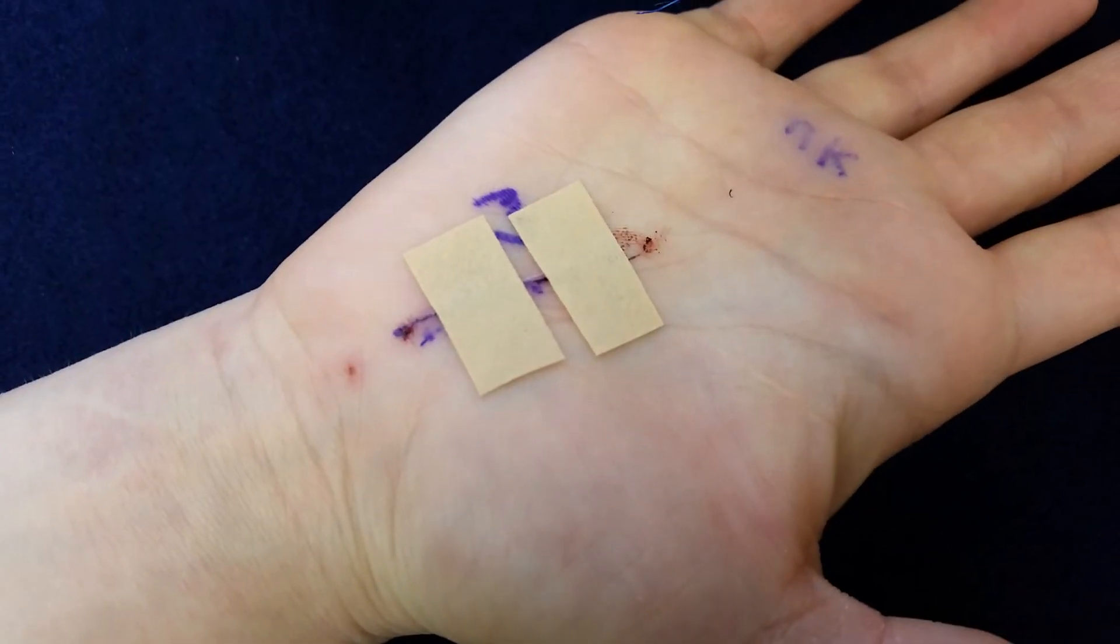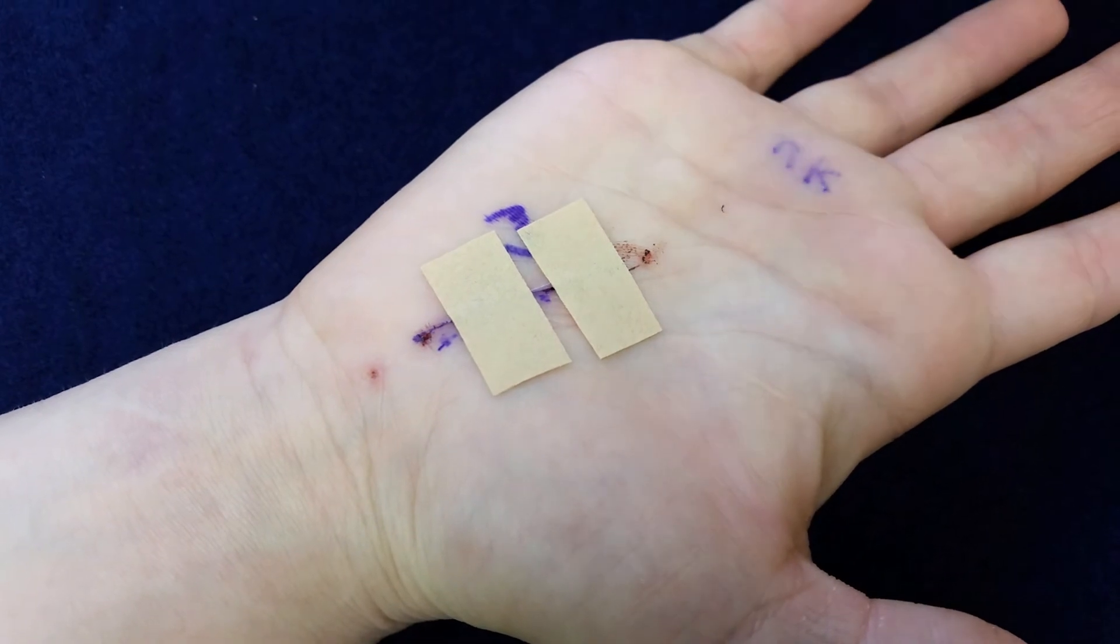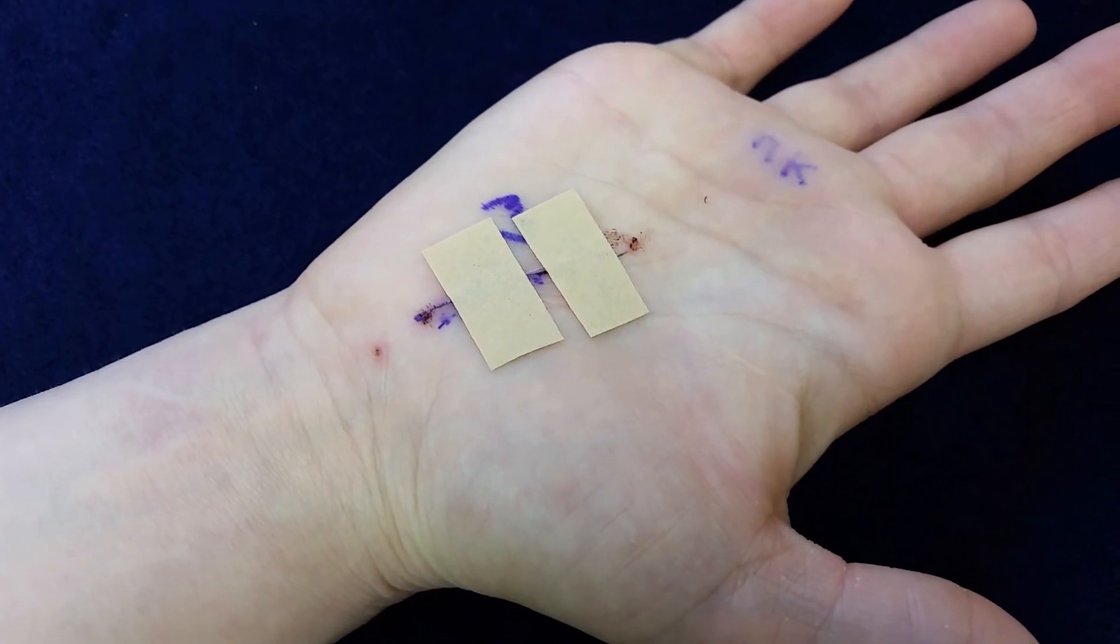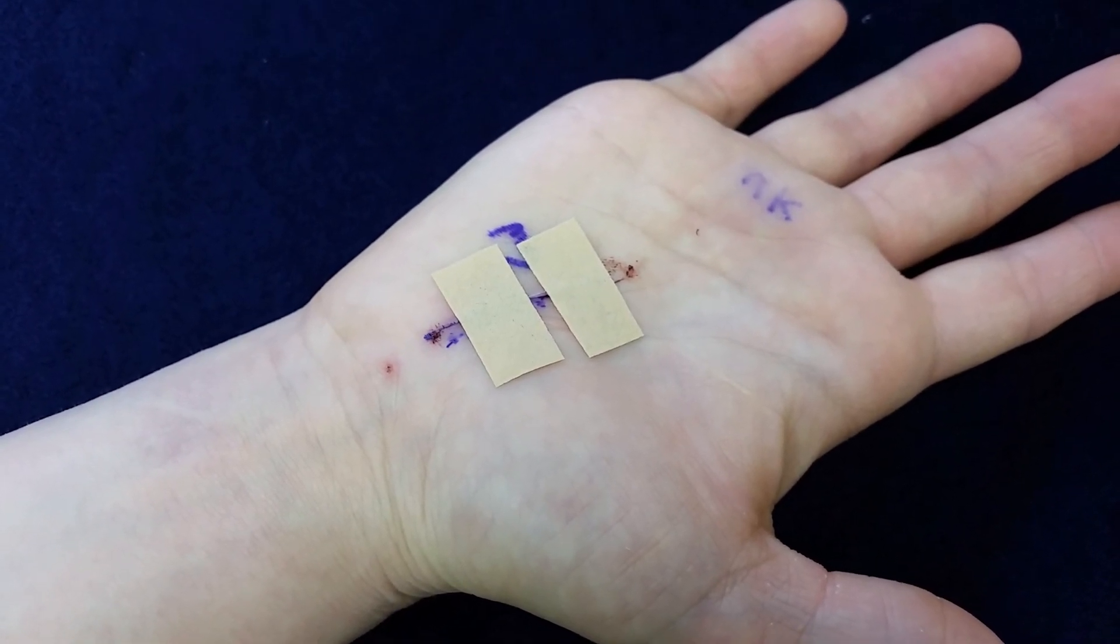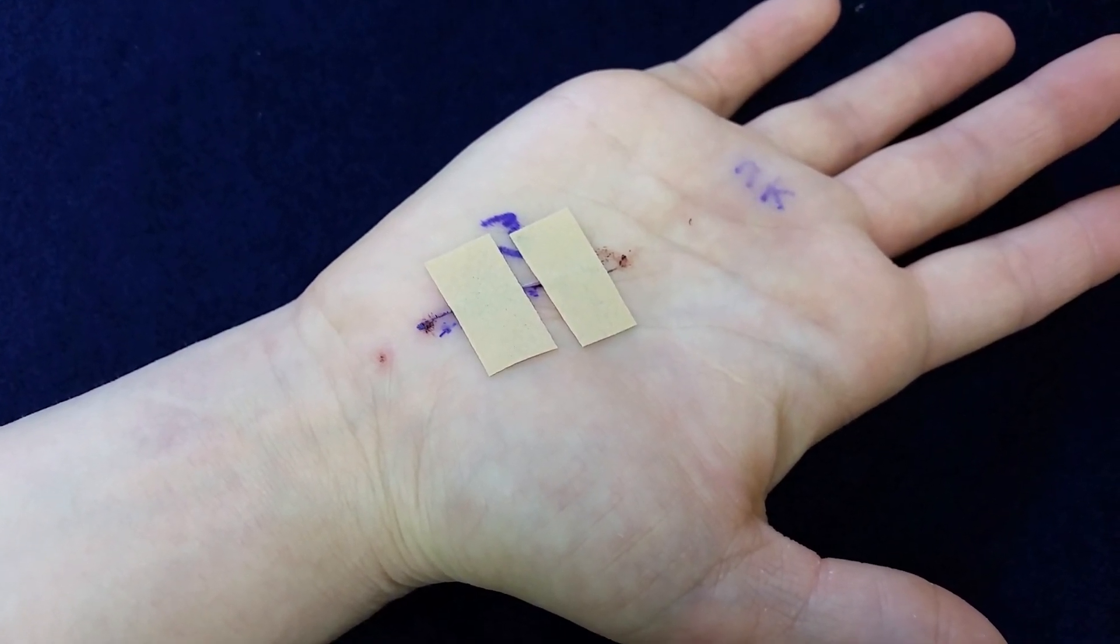And what you can see is the incision line nicely clean, dry and intact, no gapping. We've put on butterfly tapes just to take a little bit of tension off the skin, and that's how you take out a running subcuticular proline suture from the incision.